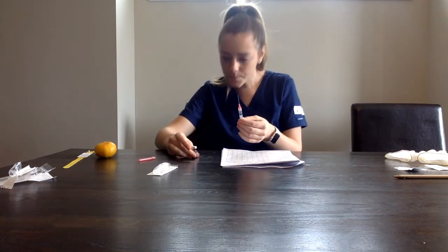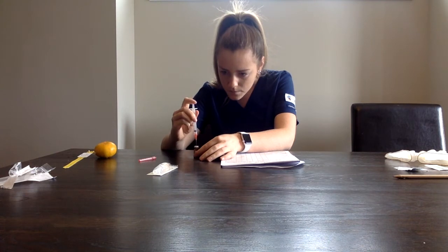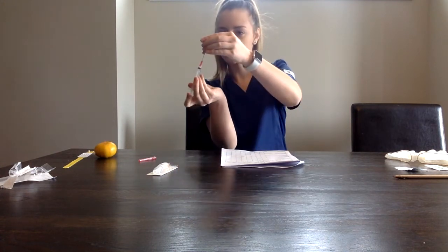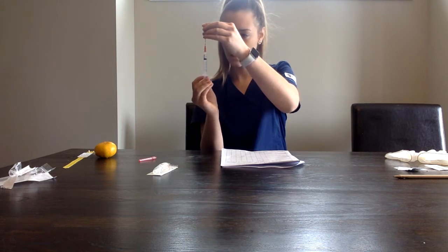So because our volume is 1 ml that we need, we first need to instill 1 ml of air into the vial. Now we can work on drawing up our medication.